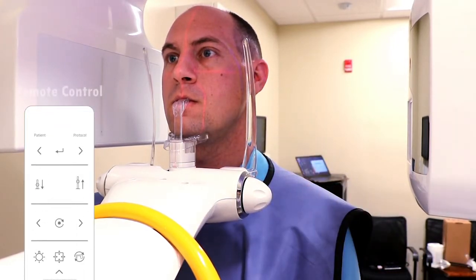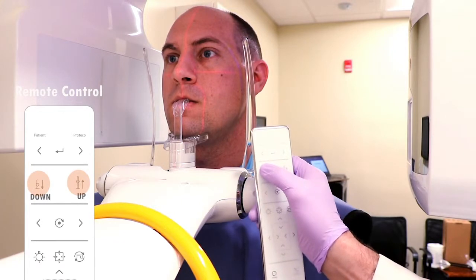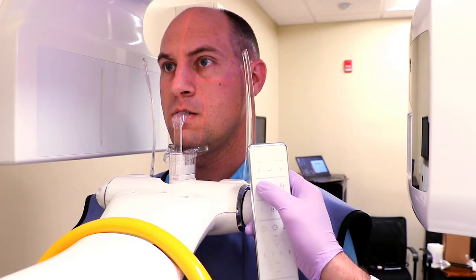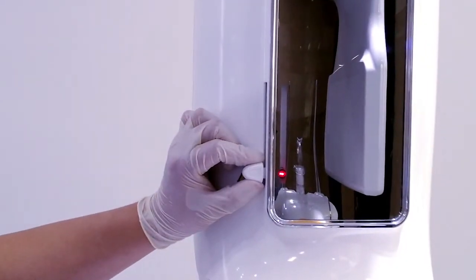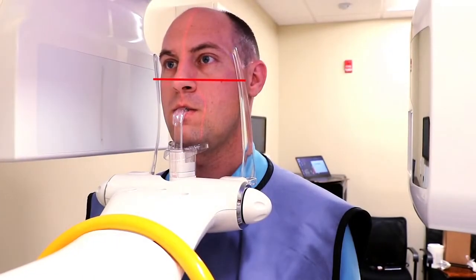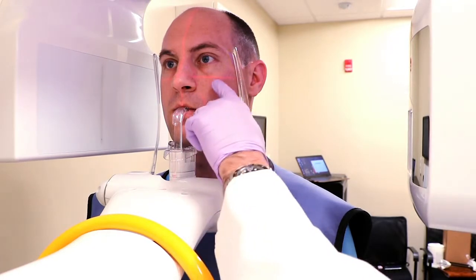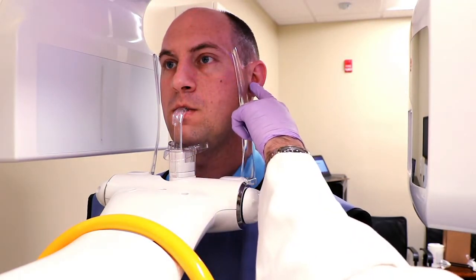Adjust the height using the remote controller so that the patient's face is straight. Adjust the horizontal laser to the patient's Frankfurt plane. If the Frankfurt plane is not parallel to the chin rest, the resulting image may be distorted.